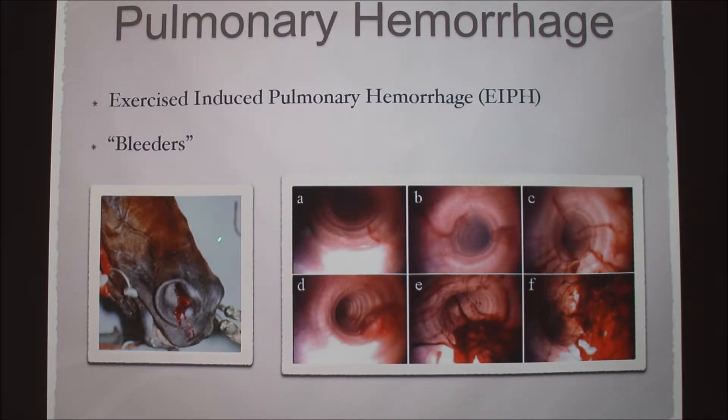As seen in this picture, this is a scope done on a horse's trachea. Up here is a very mild case — just a few drops of blood. We used a number scale, one being very mild and five being extreme, as in this picture. The whole summer I was on the track, I never saw a case as extreme as to the point where the blood was actually coming out of the nose.